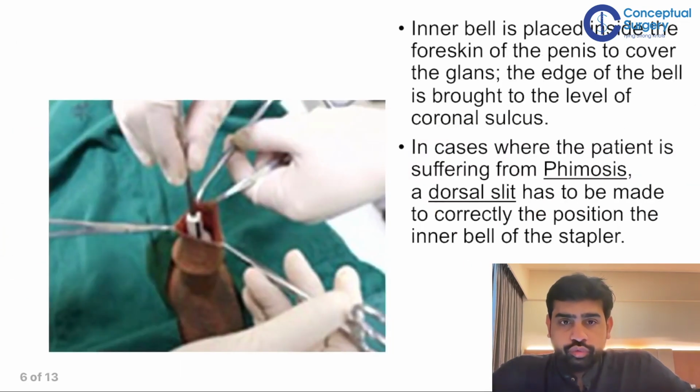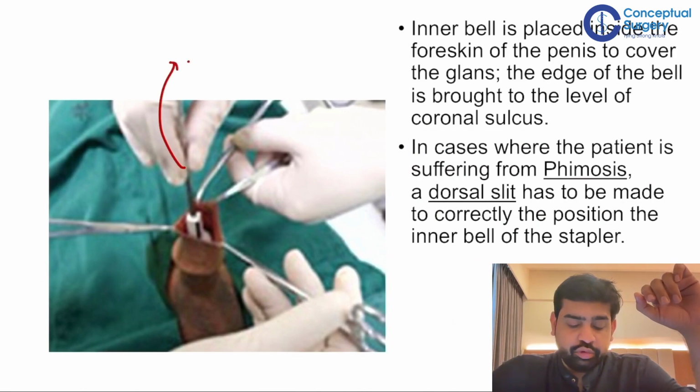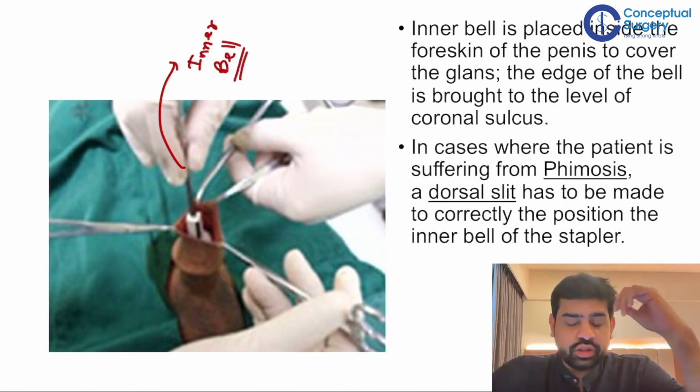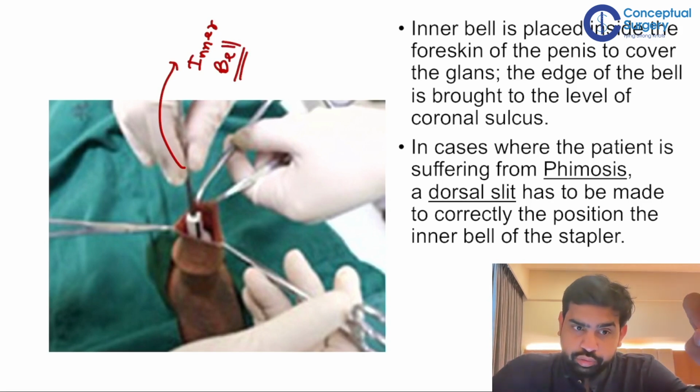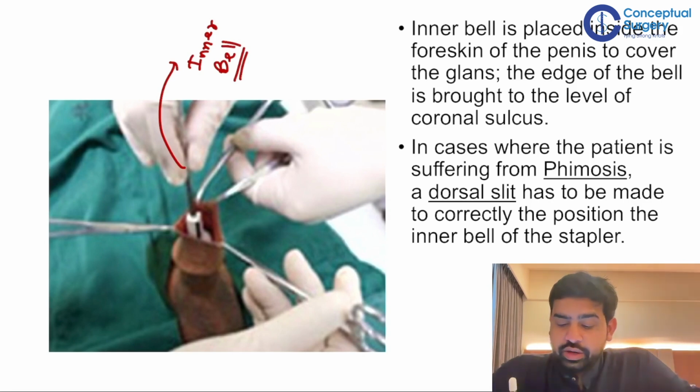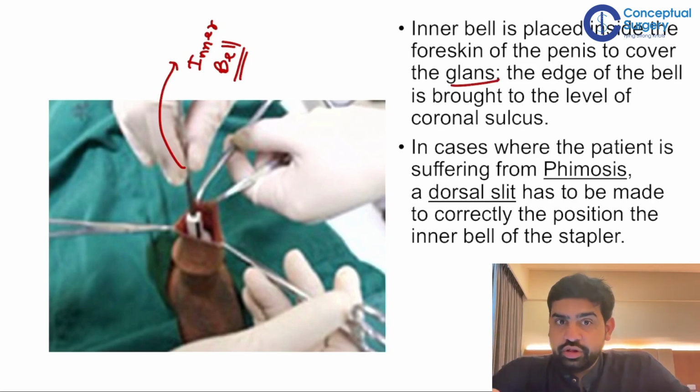Then you have to catch hold of the prepuce. The surgeon is holding the inner bell. This inner bell is passed through the prepuce inside. So the inner bell is placed inside the foreskin of the penis to cover the glans. You pass this inner bell, and this covers the glans. The edge of the bell is brought to the level of the coronal sulcus.